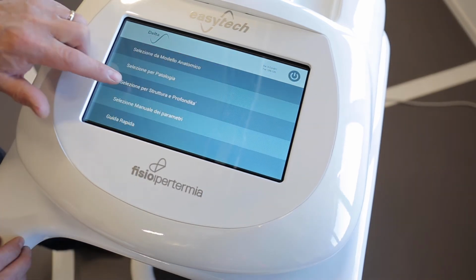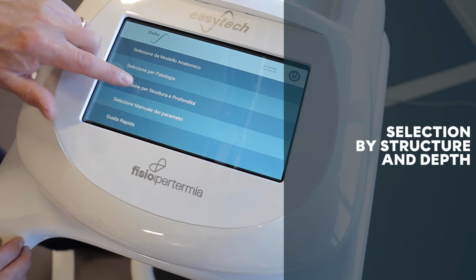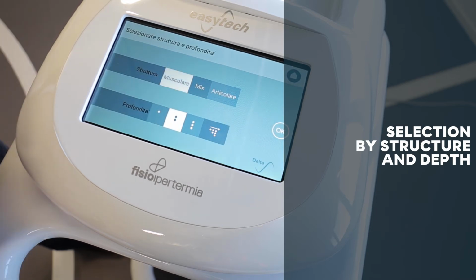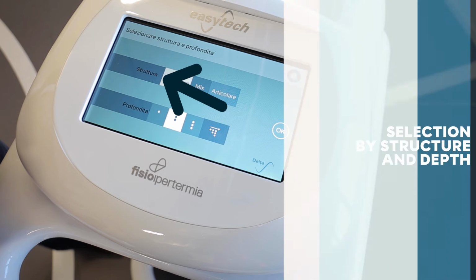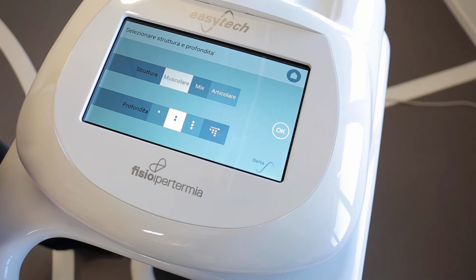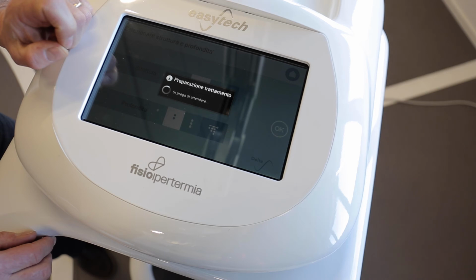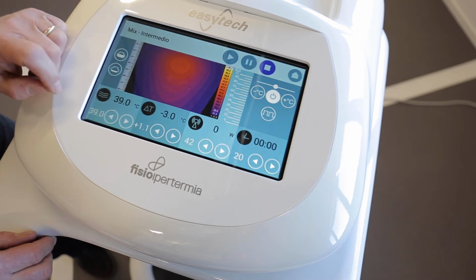The third mode is by choosing the structure of the area to treat and the depth of the treatment. In this case, there are two parameters to set: the structure, which can be muscular, articular or mixed, and the depth of the treatment, which can be superficial, intermediate, deep or scanned. Please note that scan depth is an automatic modality that moves the point of maximum heat at different depth levels during the treatment. When you're ready, press OK. Now the machine will start the treatment.